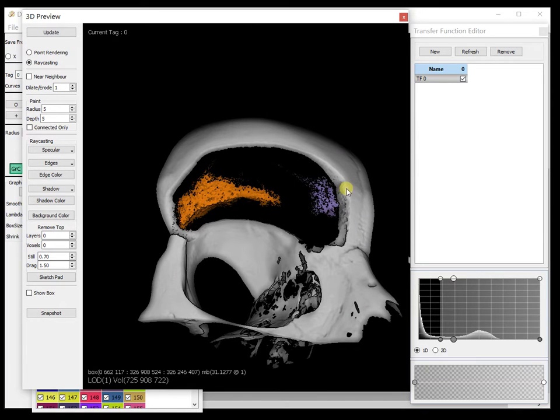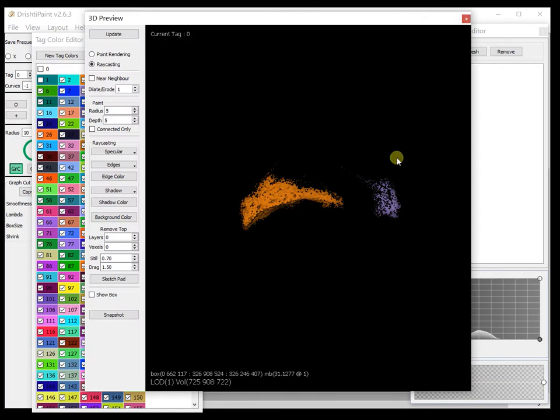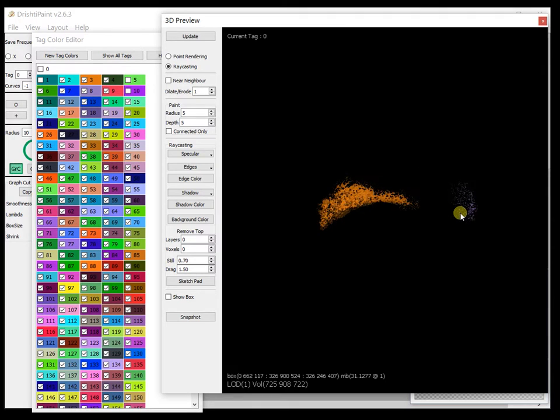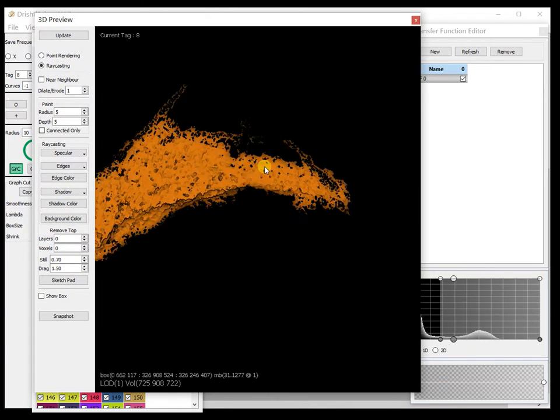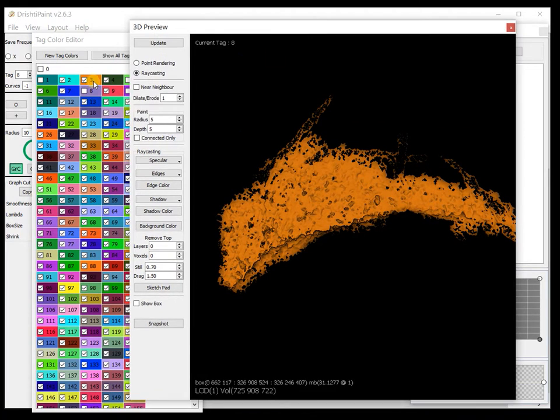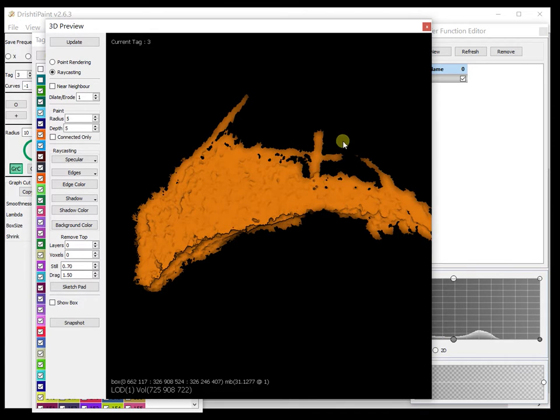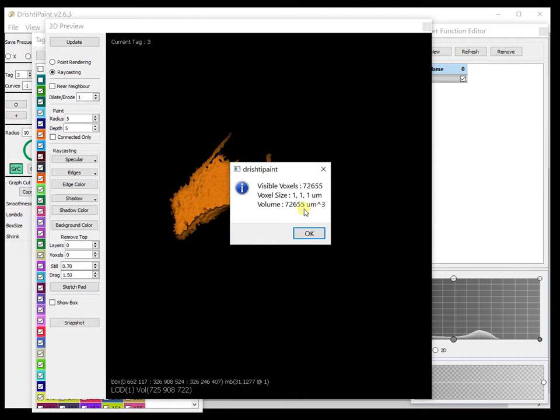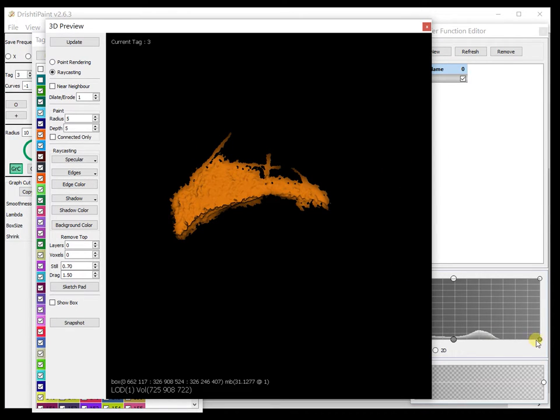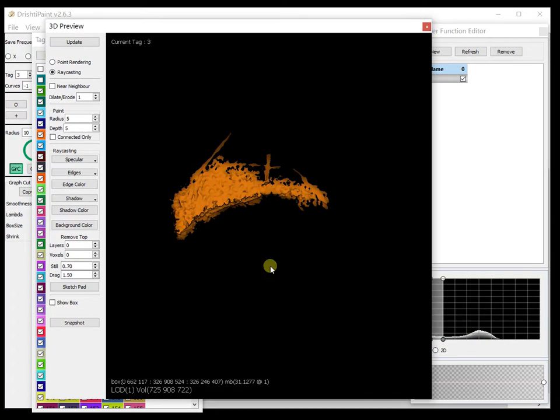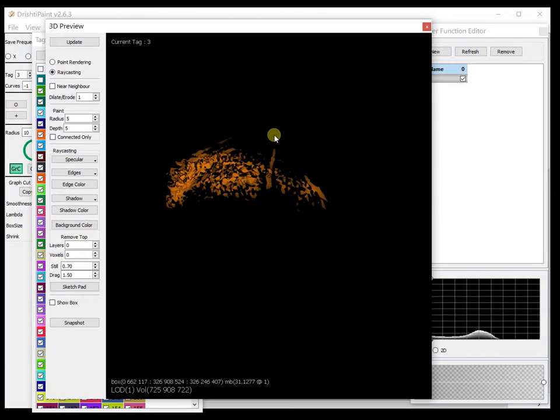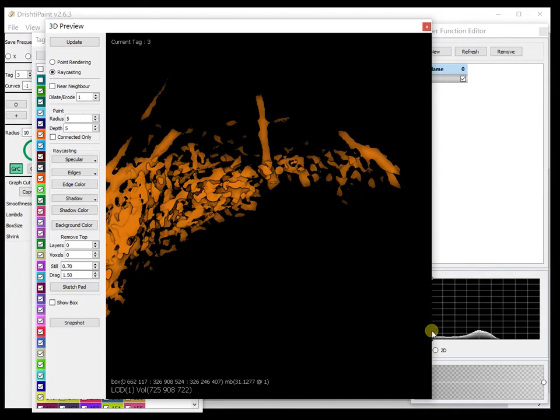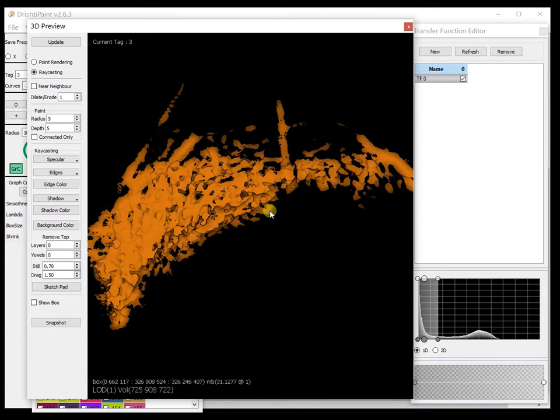And we can also get the volume of that. Let's turn off tag zero and we will also turn off tag, this is tag eight. And let us increase the transfer function to encompass everything. And now let's get the volume, that's the volume of this structure that we have segmented. And of course once we change the transfer function your volume will also change slightly depending upon your transfer function.